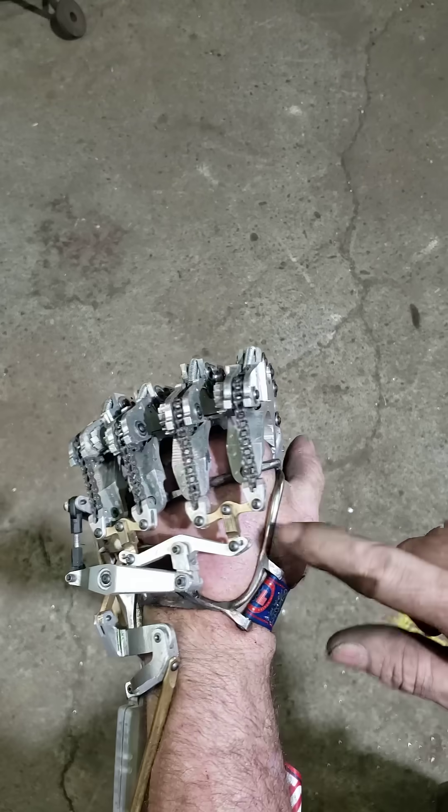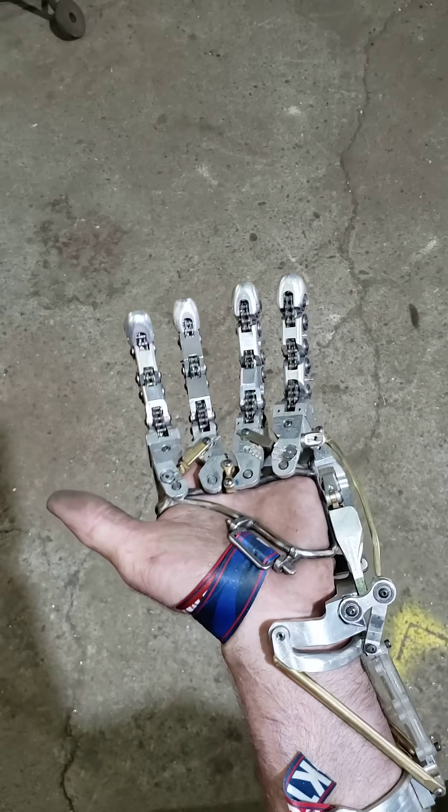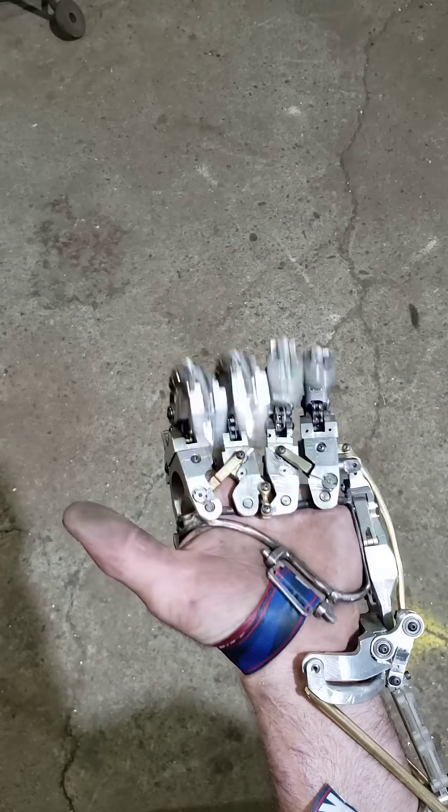And then an Arduino and a display right here, with the batteries on the forearm also. Let me know what you think.